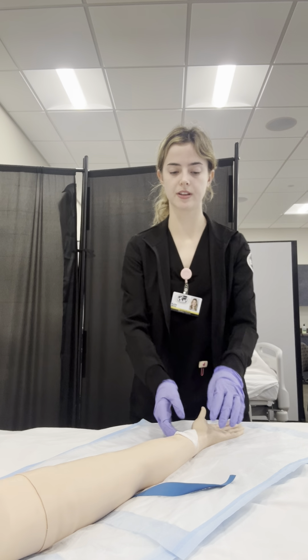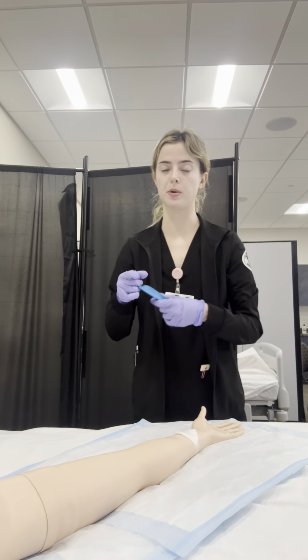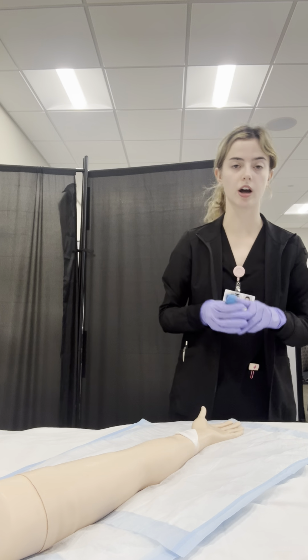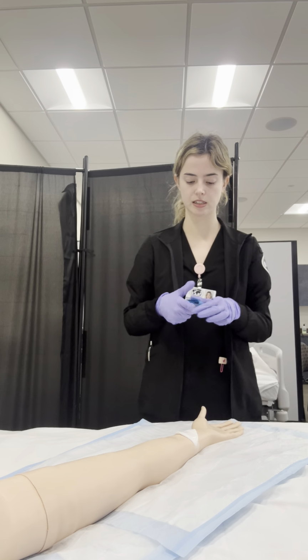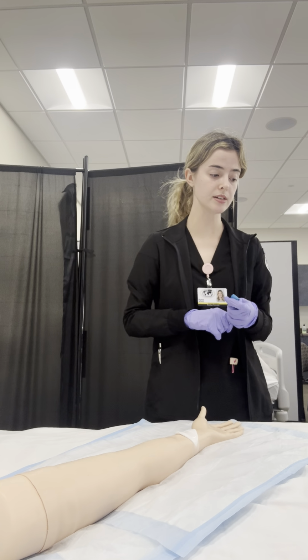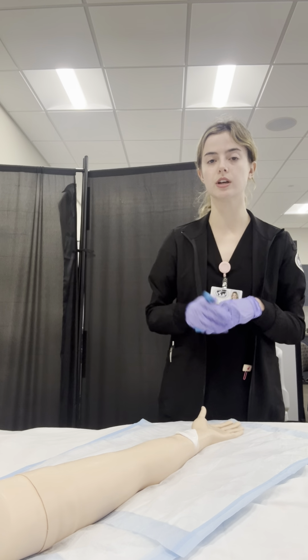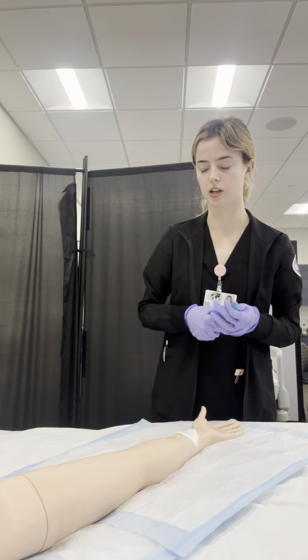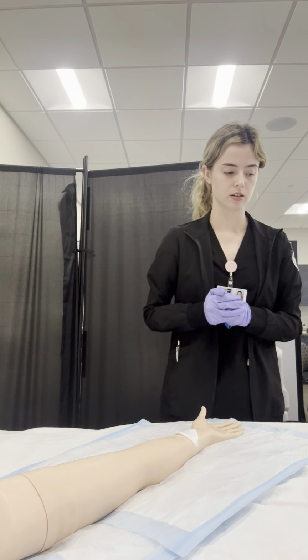And then I would leave that on here for 15 minutes. I would let my patient know that I'll be back to check on them and to leave the pressure dressing on, to let me know if they have any bleeding or pain during those 15 minutes. And then I will discard all of my supplies. And then go document it after I've discontinued, and then I document again after I come back and check in 15 minutes. That's it.